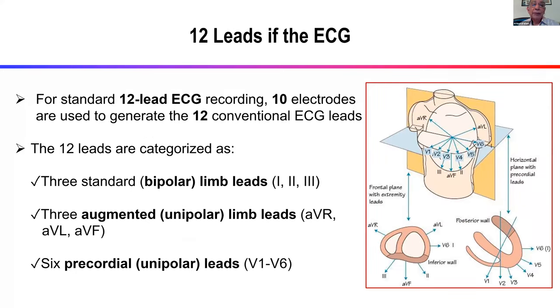So these are the types of leads. The standard 12-lead ECG is the general practice and the point of discussion today. Actually, there are a lot of other things. In 1984 in Japan, I saw a procedure known as surface electrocardiograph, which used 97 electrodes. Definitely a computer was needed. I think that is still not used nowadays as a surface ECG.